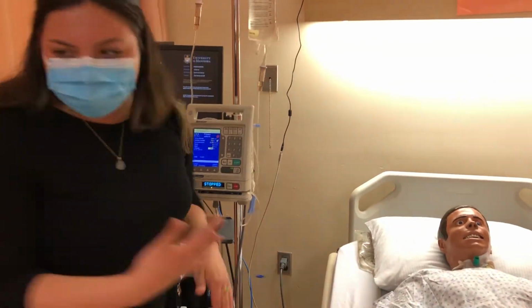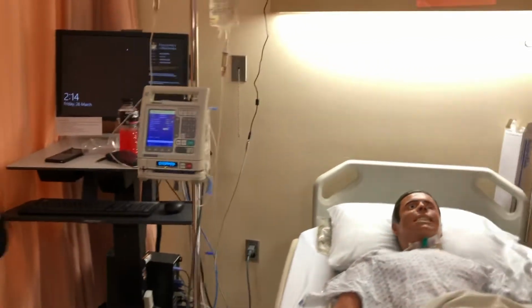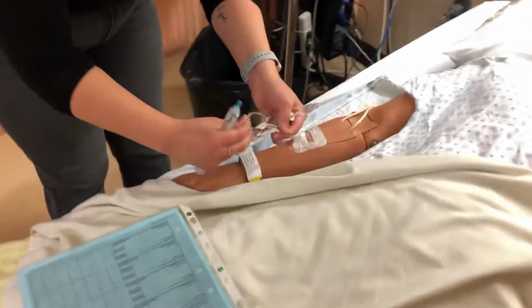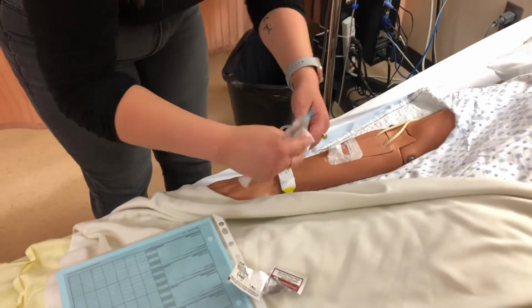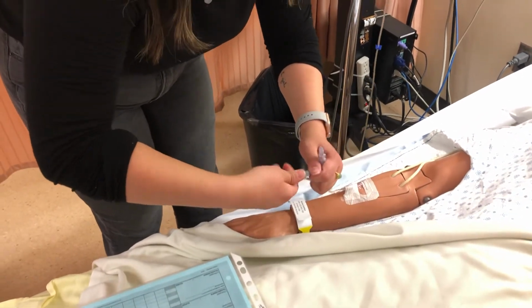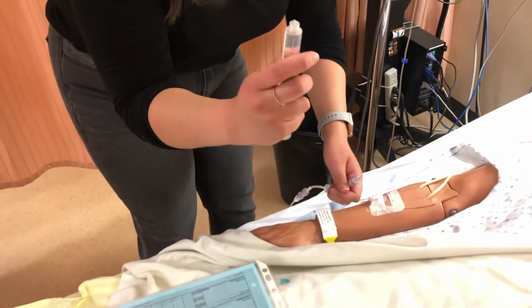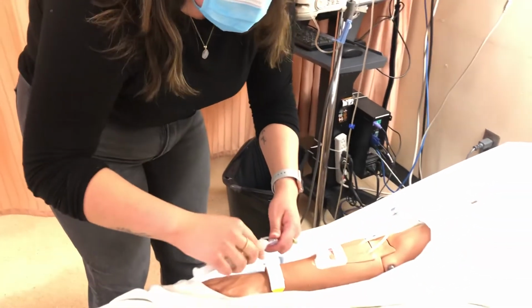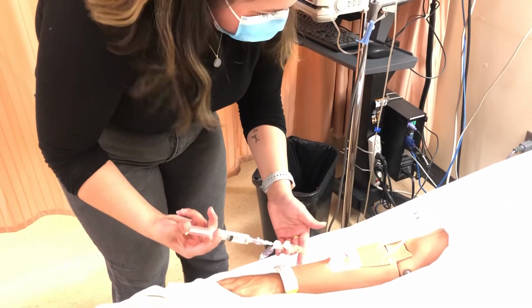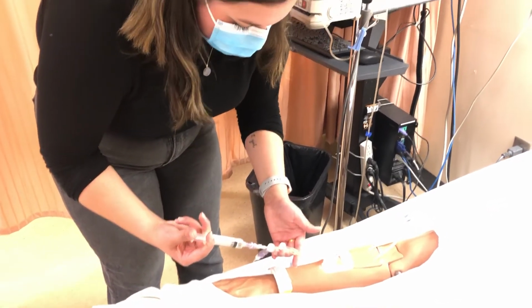So I'm going to assess the patency of my patient's IV. Notice that the patient is currently running normal saline TKVO here. And I'll just follow the line to my patient's IV. Looking at the IV, there's no redness, swelling, or any other infection. Patient doesn't complain of any pain. That's primed. And following the line to my patient's PCA, everything looks intact.